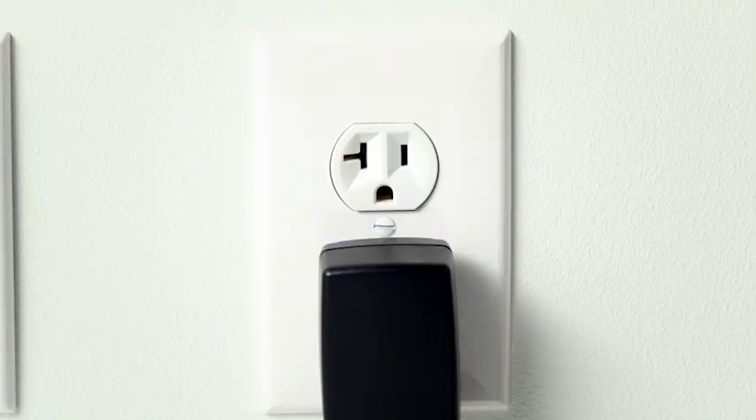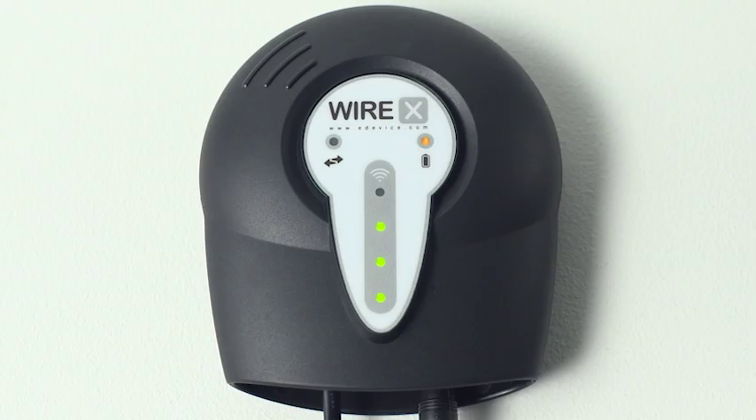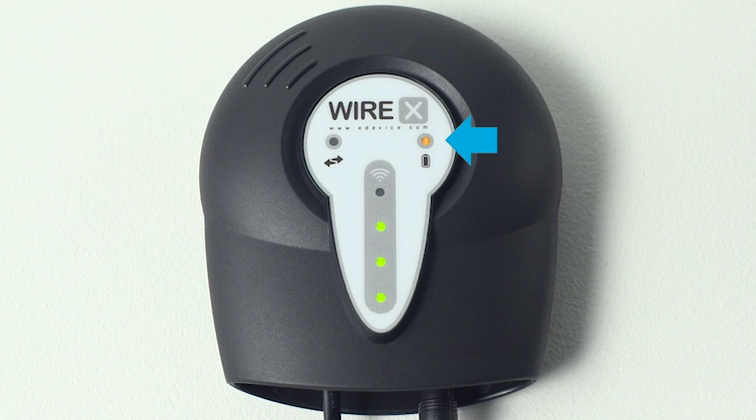The last step in setting up your cellular accessory is connecting it to power. Plug the power supply into an available electrical outlet. The light above the battery icon indicates the accessory is receiving power.